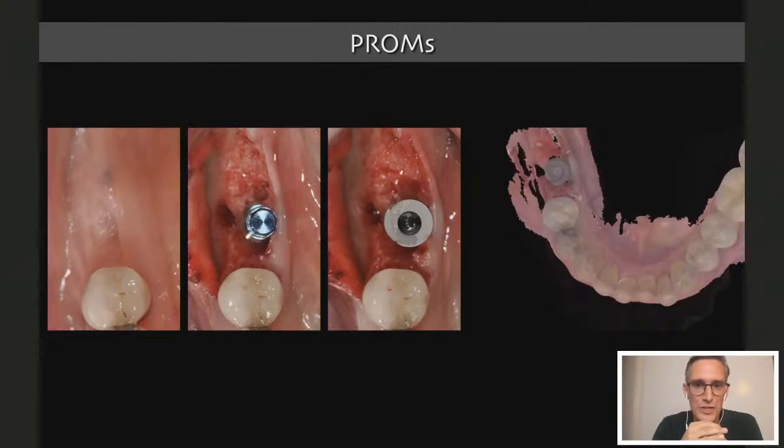It did not depend on which intraoral scanner, but once they experience an intraoral scan, you better don't come with a conventional impression again. There are several studies showing that for patients, it's much more comfortable. So this is a great value and a great advantage.